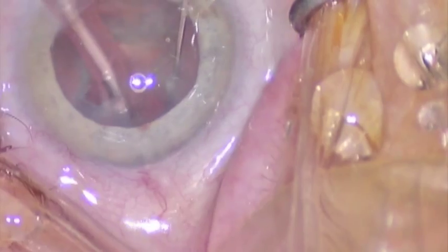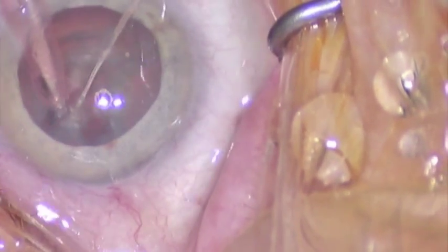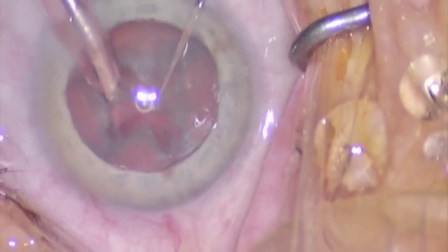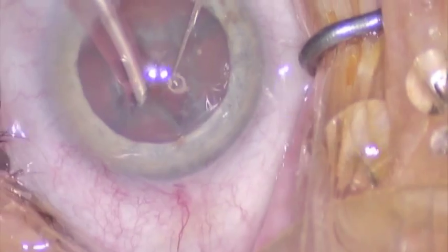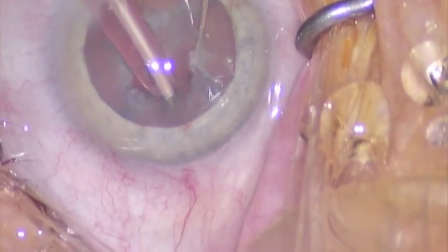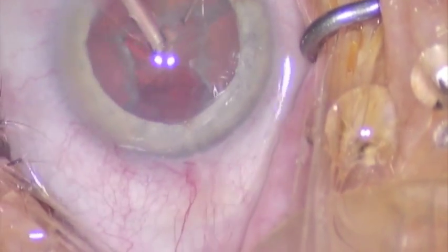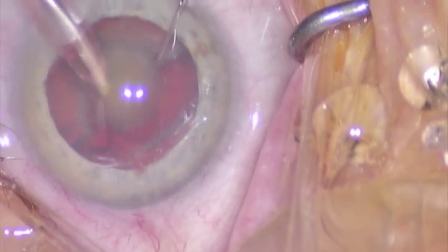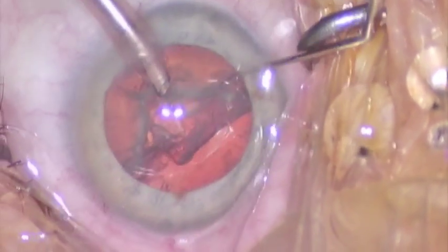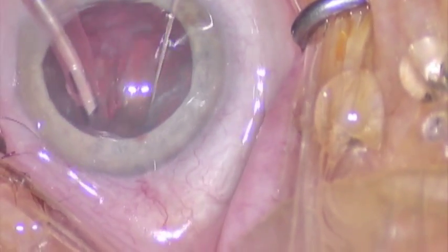In this way we create a plus without having to rotate the lens. Very innovative and unique technique. It's going to allow you to divide the pieces into quadrants right there, without having to spin and rotate the lens. Then we have 2 quadrants, 3 quadrants, and 4 quadrants. Sometimes when you go to sculpt to remove your piece, you may have to extend your crack, make sure it goes all the way to the edge, but it's a useful way to enable you to remove all 4 quadrants in a case where there's weak zonules and you don't want to rotate, or in a case you simply don't have the ability to do it with ease.